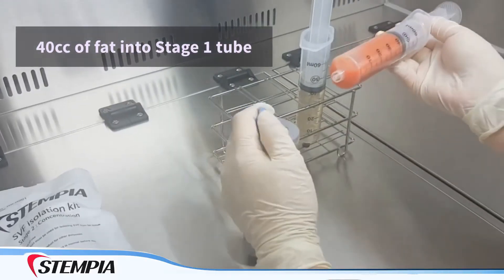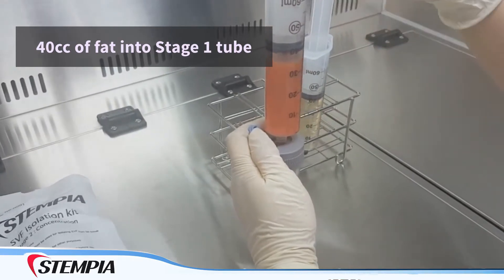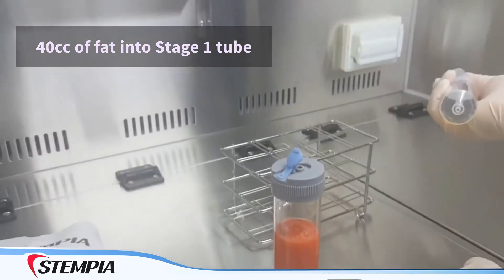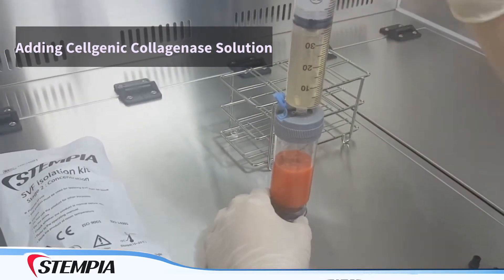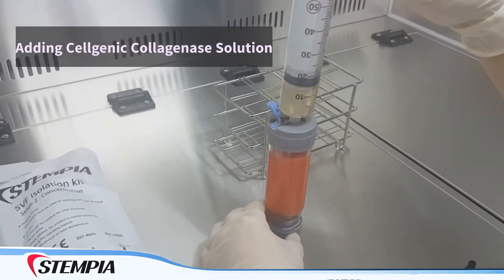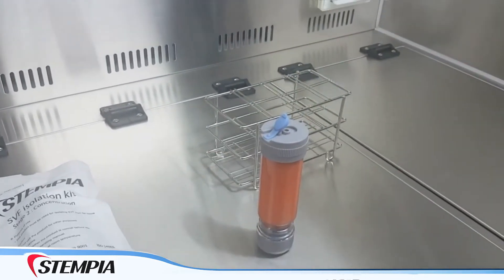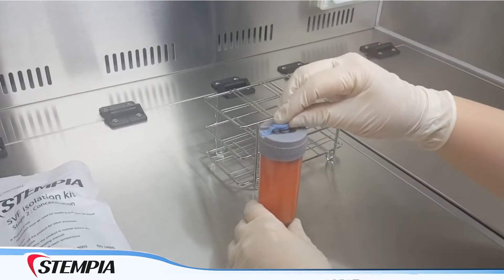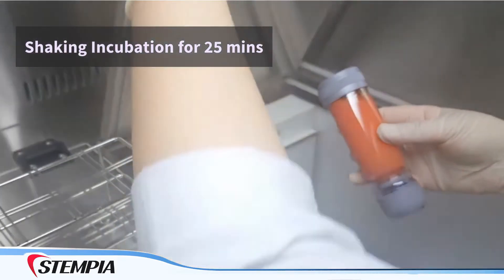The fat is then placed into the Stage 1 tube. Cellgenic collagenase solution is added. The mixture of fat and collagenase is then placed into a shaking incubator for 25 minutes.